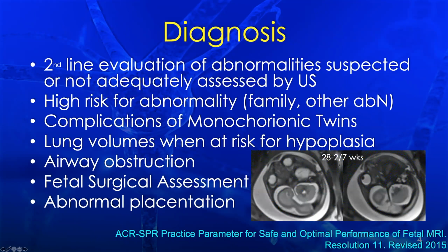And here's an example of a 28-weeker that was referred after an ultrasound for small cerebellar size, and the diagnosis on MRI becomes clear, which in this case is rhombencephalosynapsis.